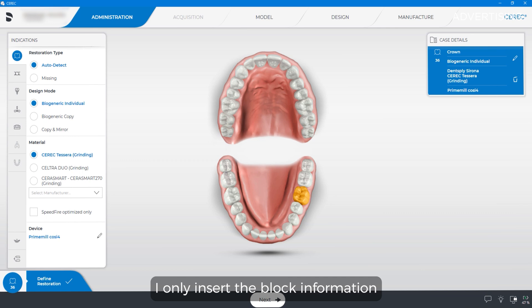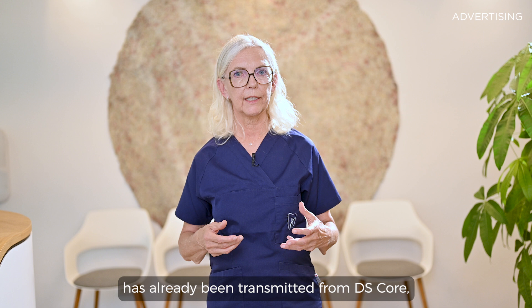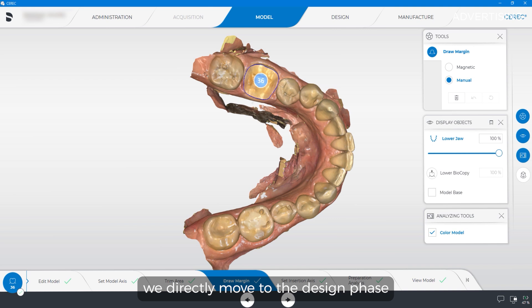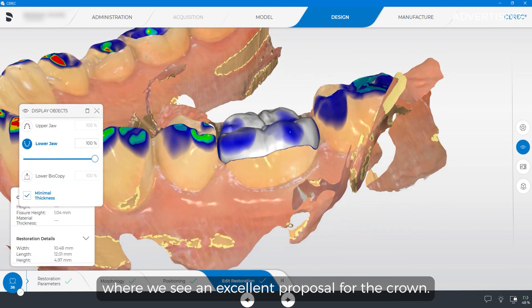With the CEREC software 5.3, I only insert the block information in the administration phase. All other information has already been transmitted from DS-Core, and as the scan file is already there, we directly move to the design phase where we see an excellent proposal for the crown.